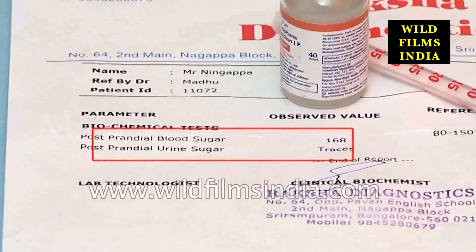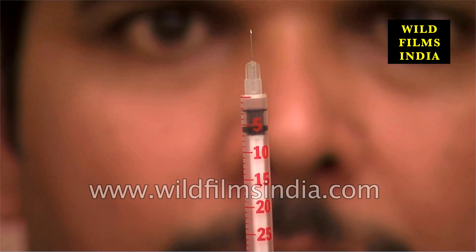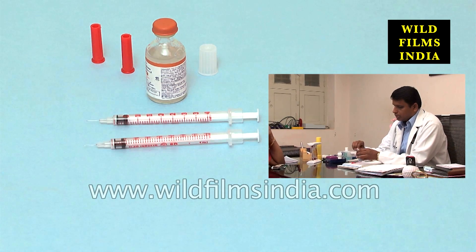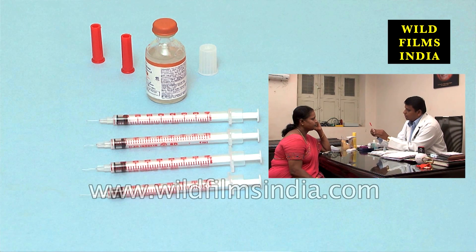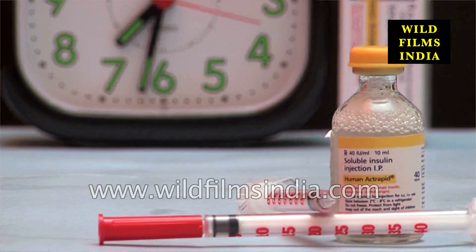Based on blood glucose levels and other medical tests, doctors will determine the type of insulin to be injected. Most patients with type 2 diabetes start off with one injection a day, and some may have as many as four depending on the doctor's prescription. Patients have to take their insulin injections at the right time and by the right method as prescribed by the doctor. Usually, patients take their insulin shots half an hour before meals.